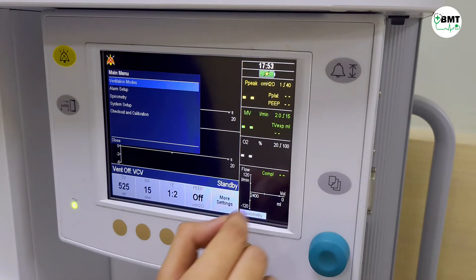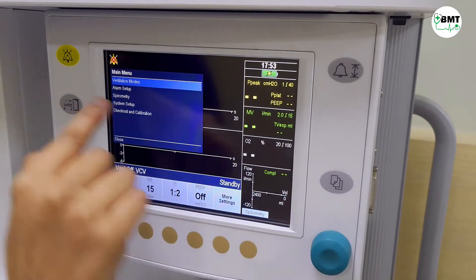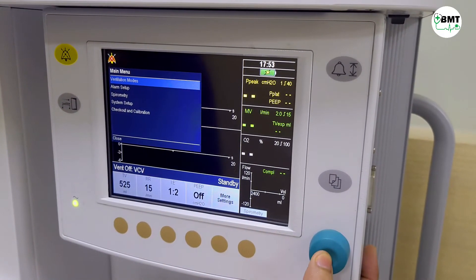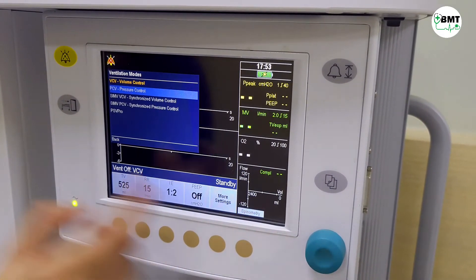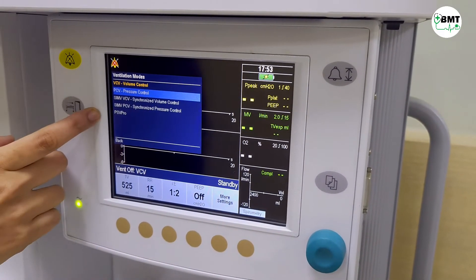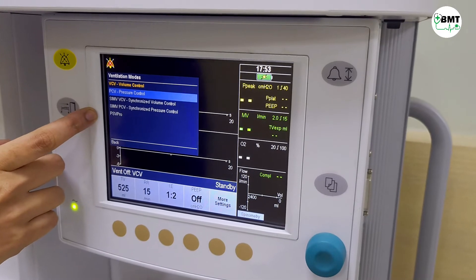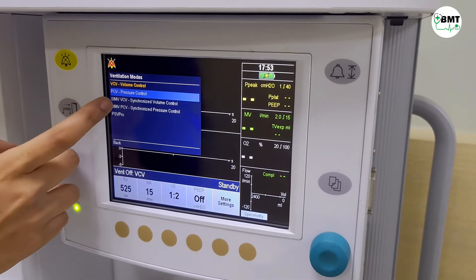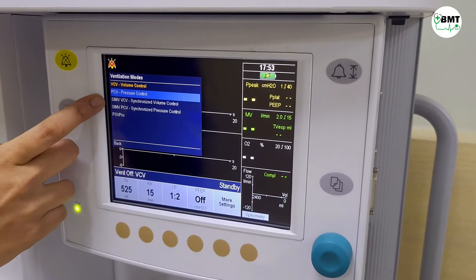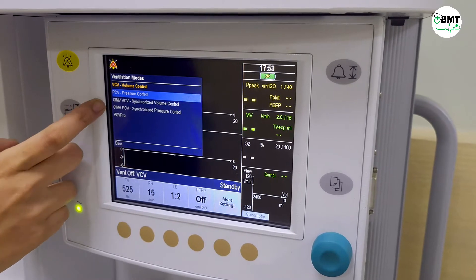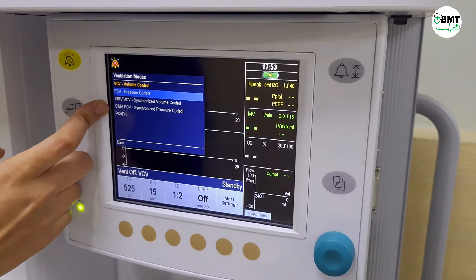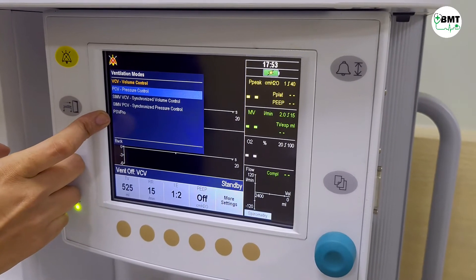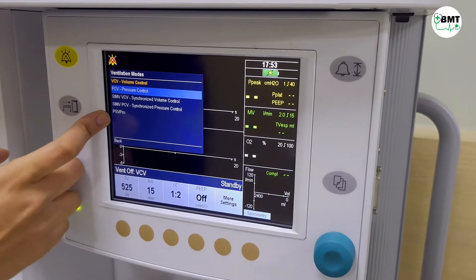And this is to change the ventilation modes. The available modes are: volume control mode, pressure control mode, synchronized volume control, synchronized pressure control, and pressure support ventilation mode.